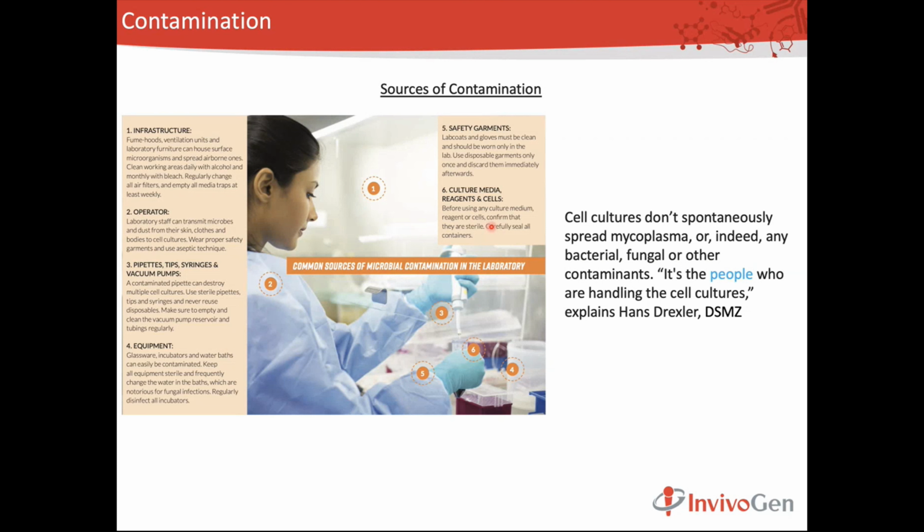Cell culture media, for example FBS, was a major source of mycoplasma contamination a long time ago, but not now, because the standard has been upgraded and more people are aware of this. The manufacturers have already paid special attention to keeping their reagents clean. So this was a major issue in the past, but not now.